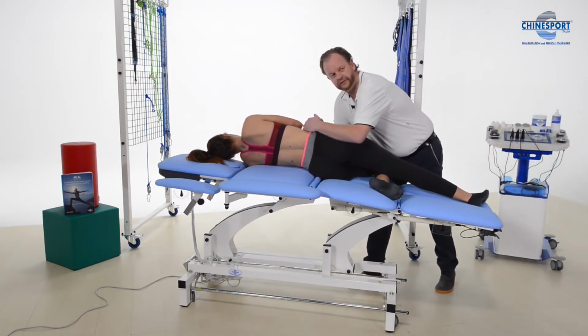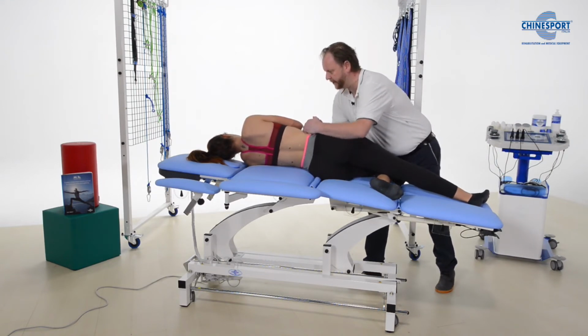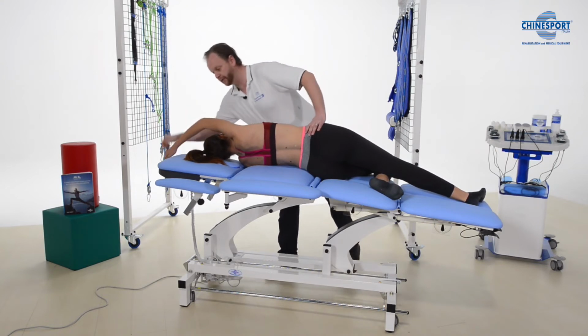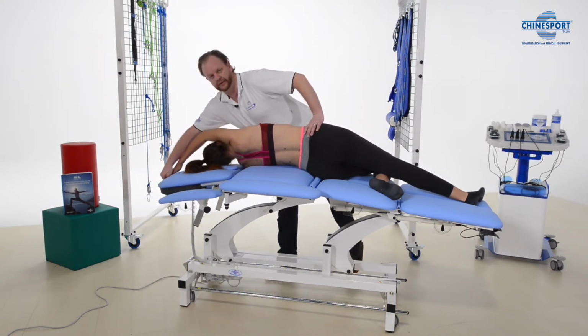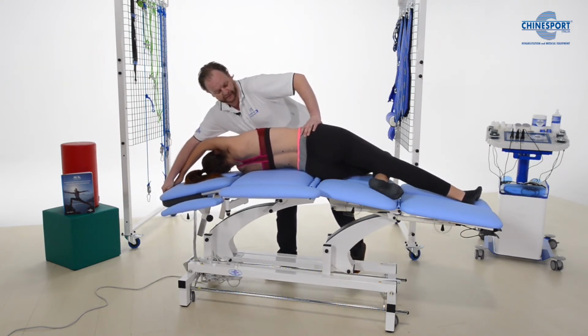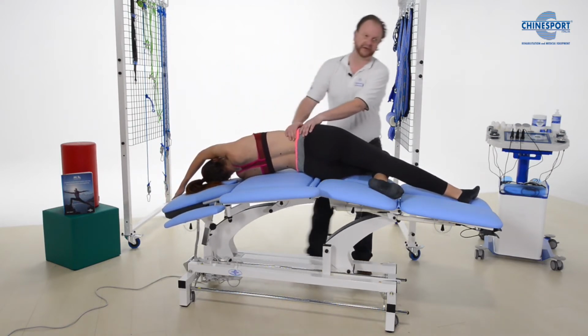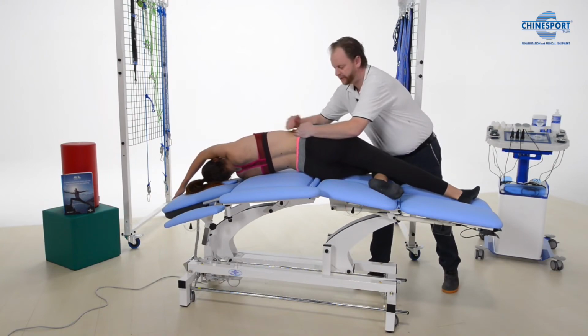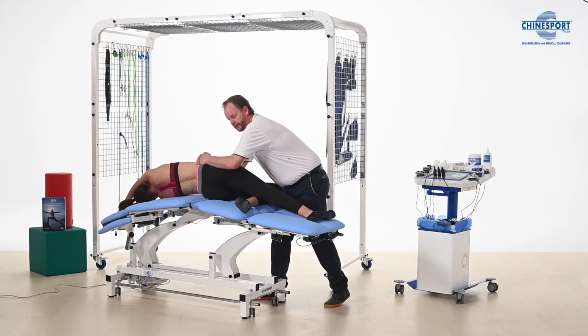Let's do this quadratus lumborum muscle. If we want a little bit more, we can stretch up here. We can lower this section here. We can go down, and we have more stretch here on the side. She's opening up all the intercostal muscles. And we can hold here.